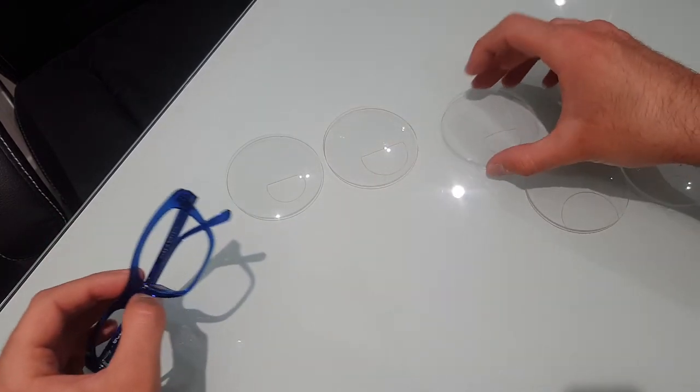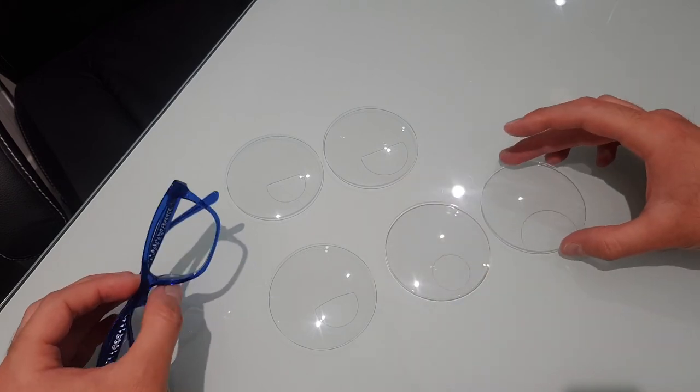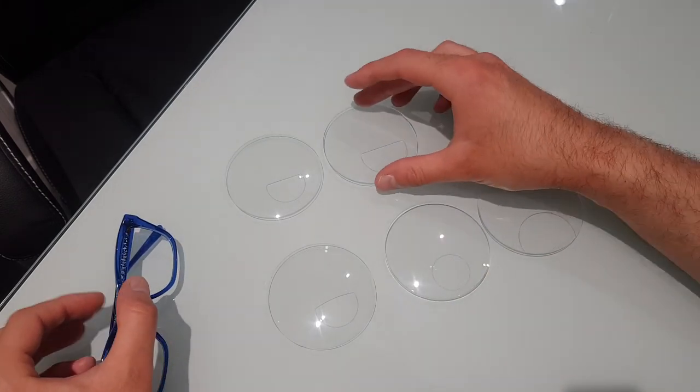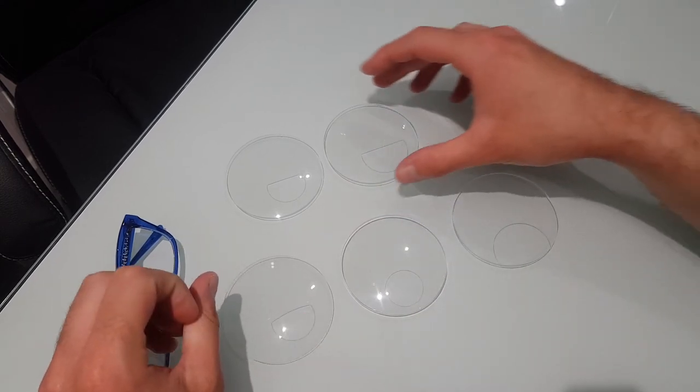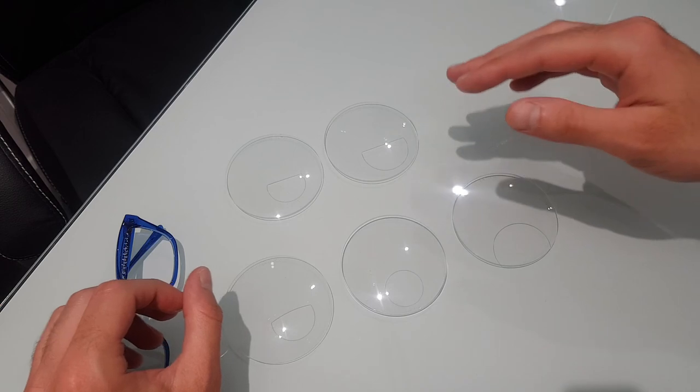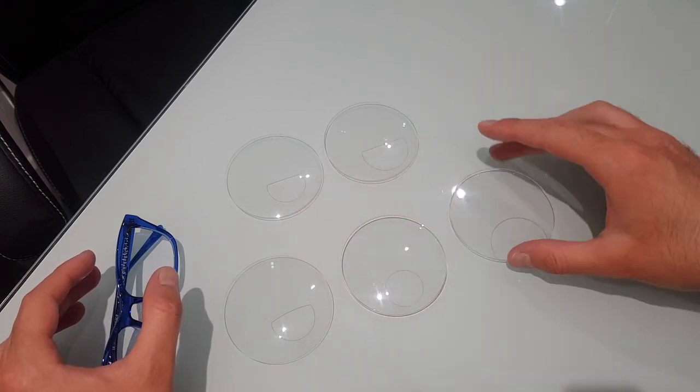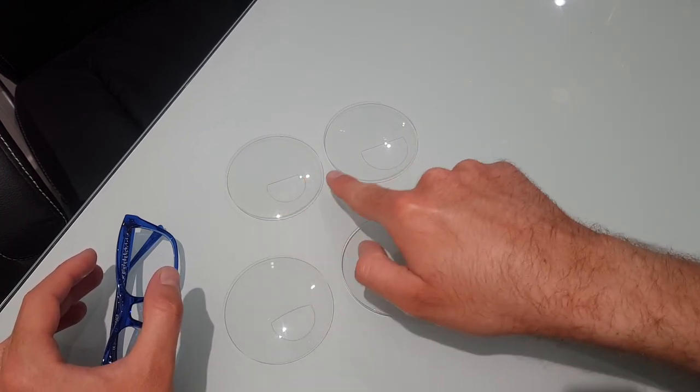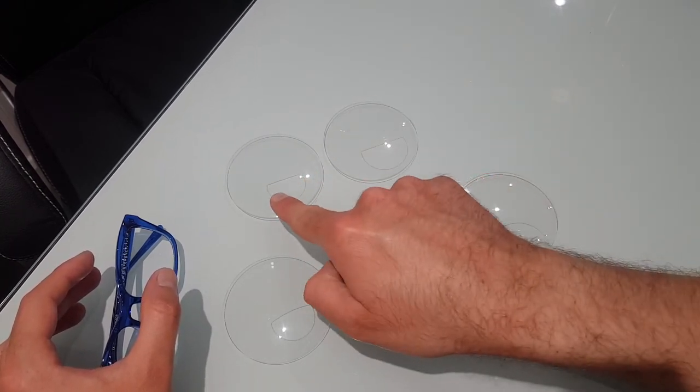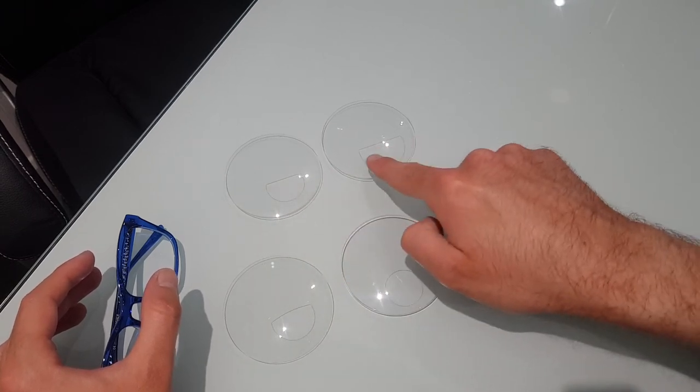So I hope that makes sense. Let me know in the comments below if you've tried any of these or you've got any questions about it because it is a bit of a tricky thing to get your head around. Hopefully these examples have shown you some real good hands-on examples of what the different types of segment are. Just to recap, we've got D-segs because it's the shape of a D and the number after that represents how wide that top part is.